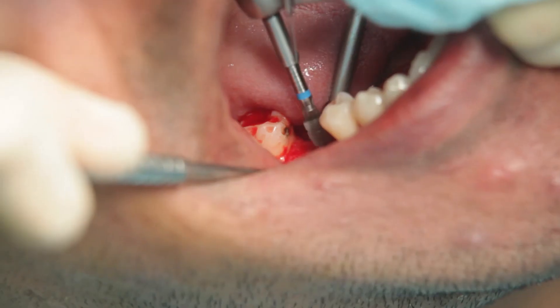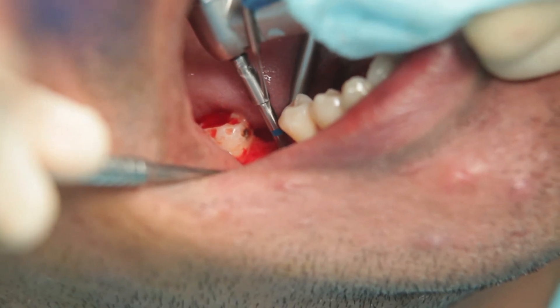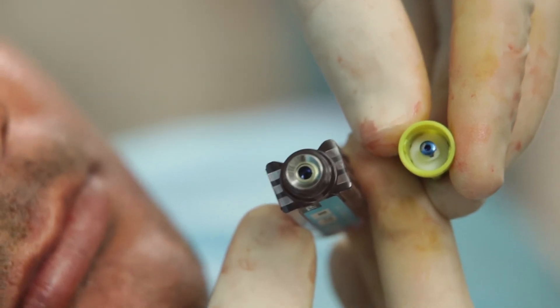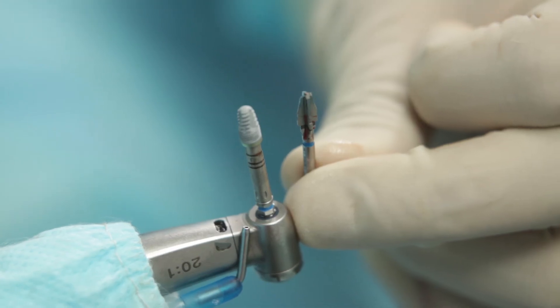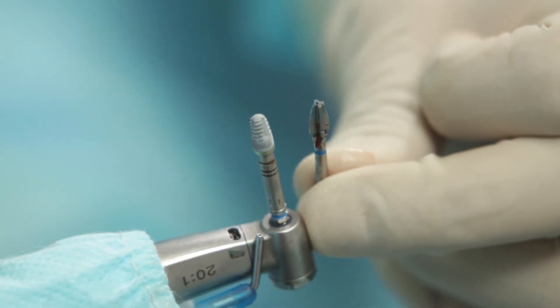This is my final drill now, and I will make sure I just stop as I reach the 8 mm mark. I have now picked up my Biodenta implant, which is a 4.1 by 8 mm, and I will carry it to the osteotomy site. You can see that the shape of the implant and the drill is similar, giving it a cone-in-cone configuration.